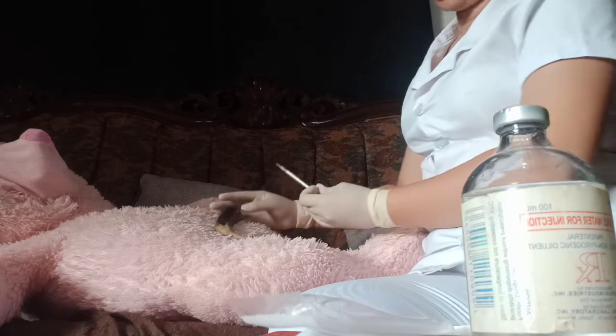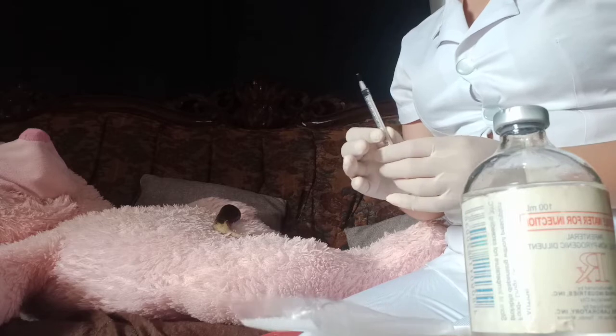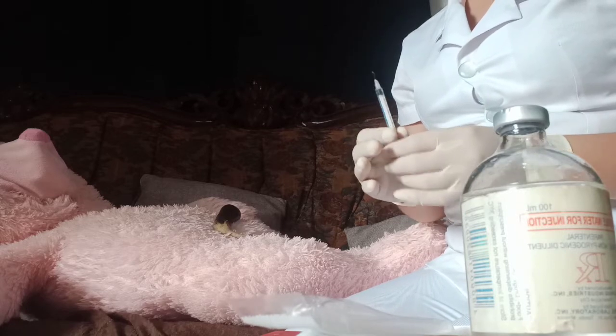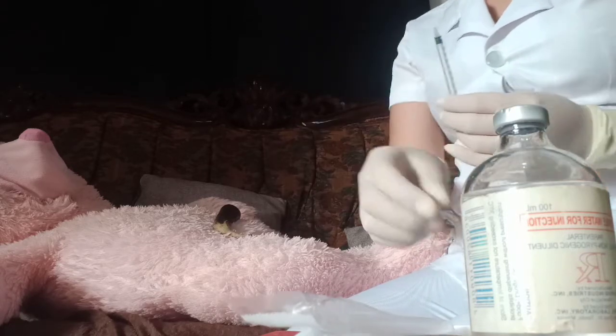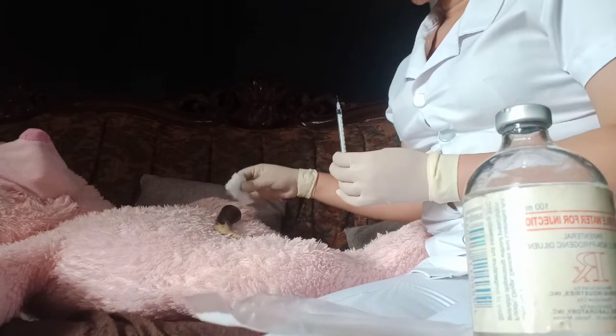Then remove the needle, pulling smoothly along the line of insertion while depressing the skin with your non-dominant hand. If bleeding occurs, apply pressure with dry sterile gauze until it stops.